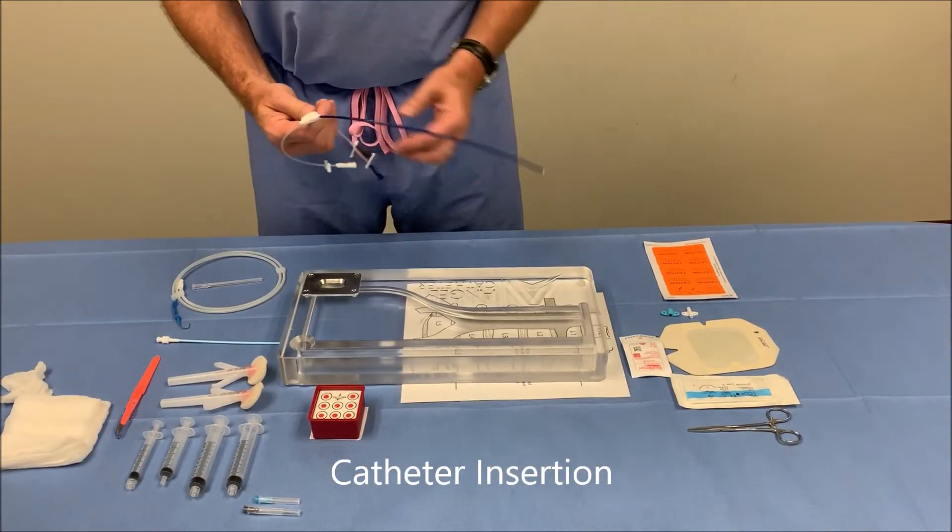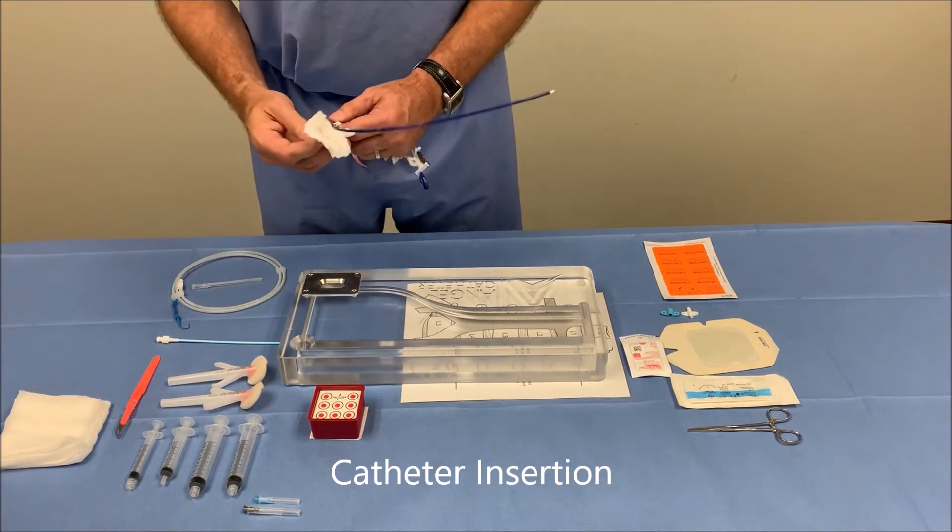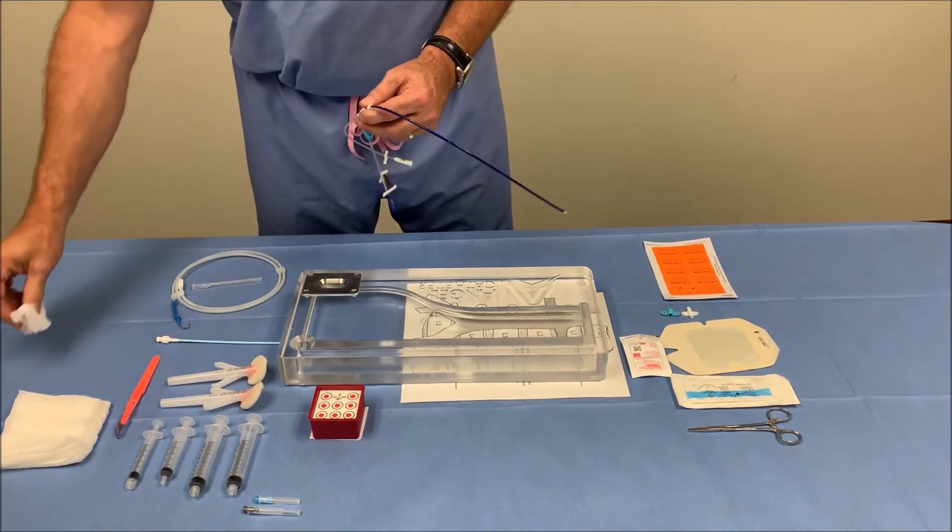Now we're ready to insert the Angel catheter. First, we want to activate the hydrophilic coating by taking sterile saline and wiping down the external part of the catheter.